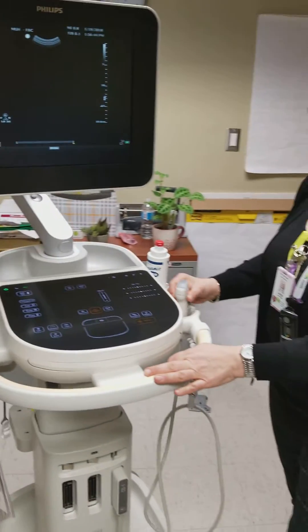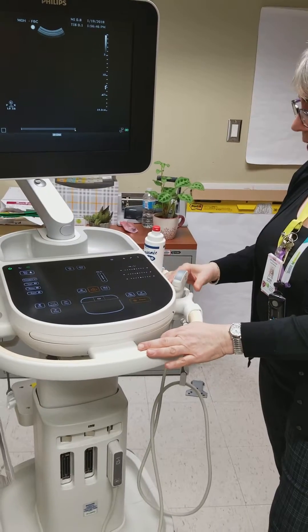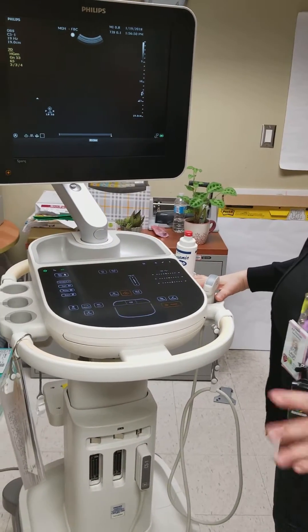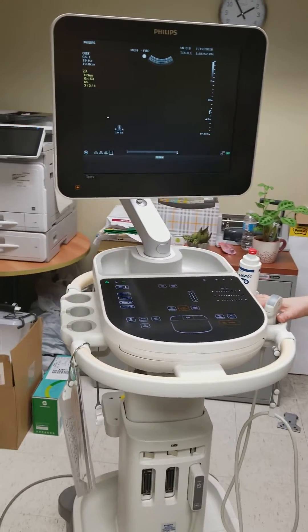There is one abdominal ultrasound probe on here. We don't have the vaginal probe on it — we're thinking it'll probably be kept in the OB call room.